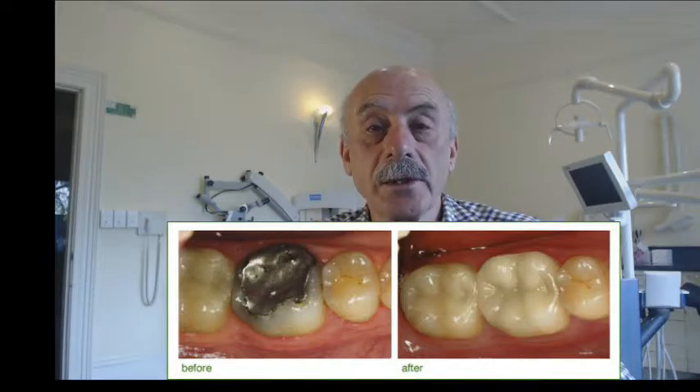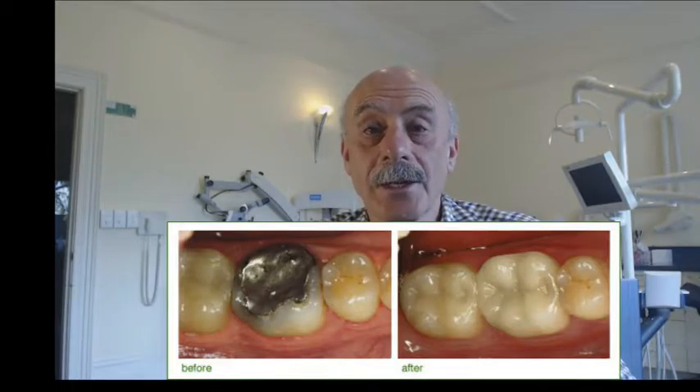The restoration is then milled out of that solid block of porcelain. You then come back in, we trial fit the restoration, make any adjustments to make sure it's a perfect fitting restoration, and then it's bonded into place. Once it's bonded in, you've got something that looks fantastic because it blends in really nicely with your existing tooth, and it's hard-wearing and usually long-lasting.